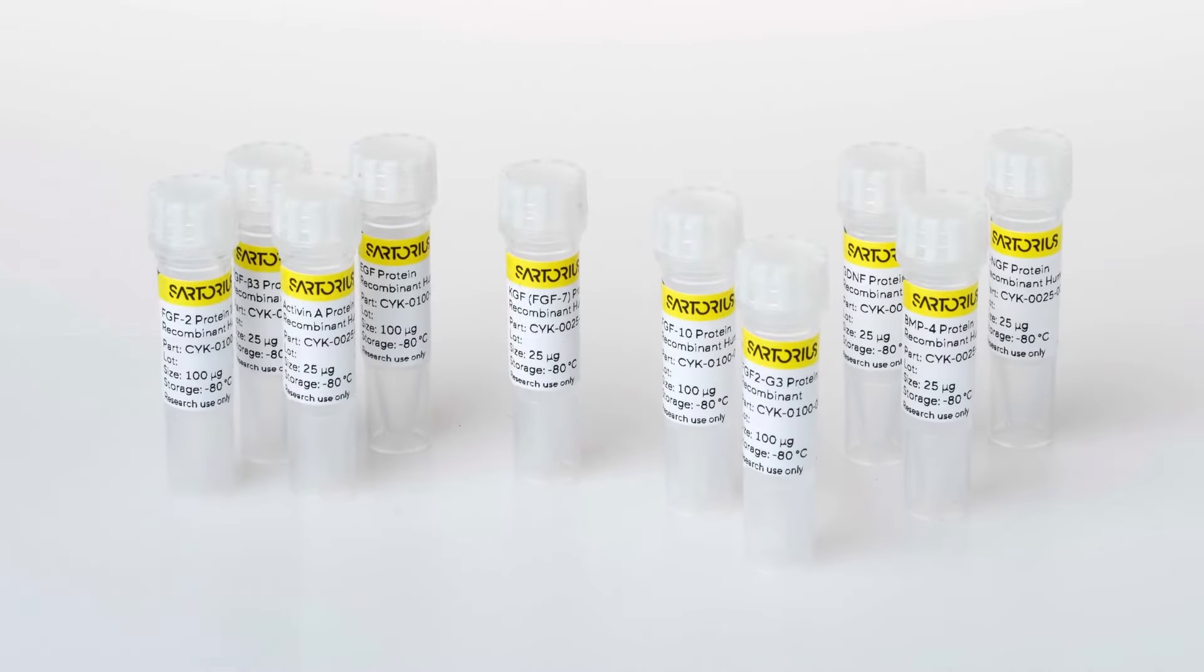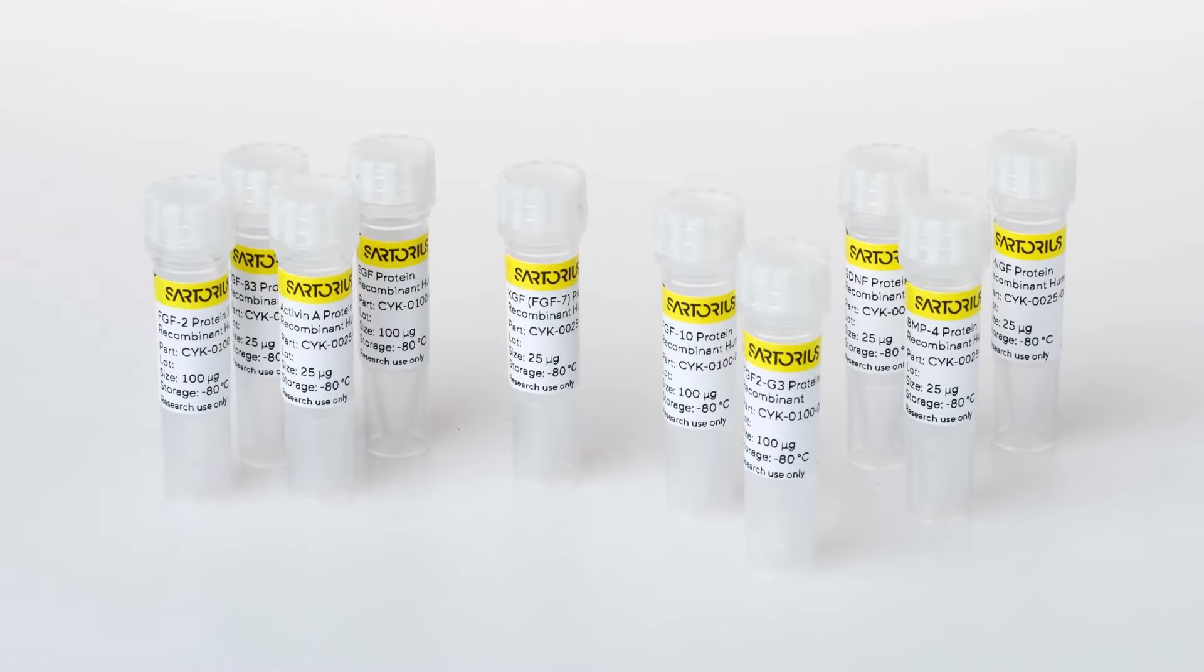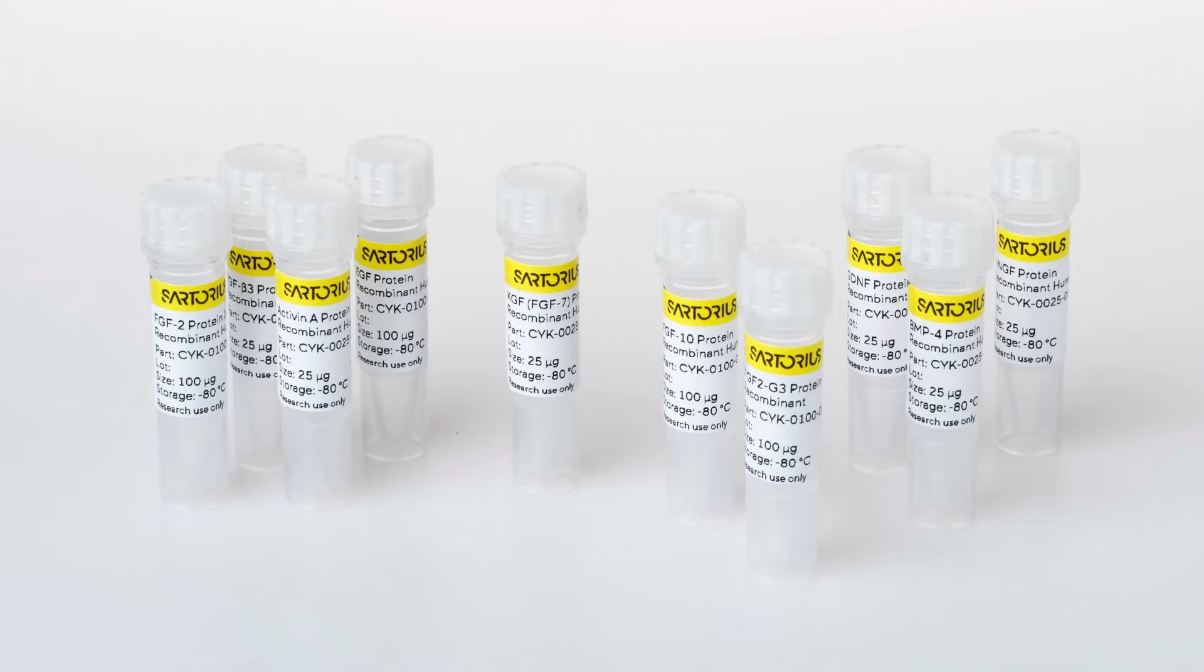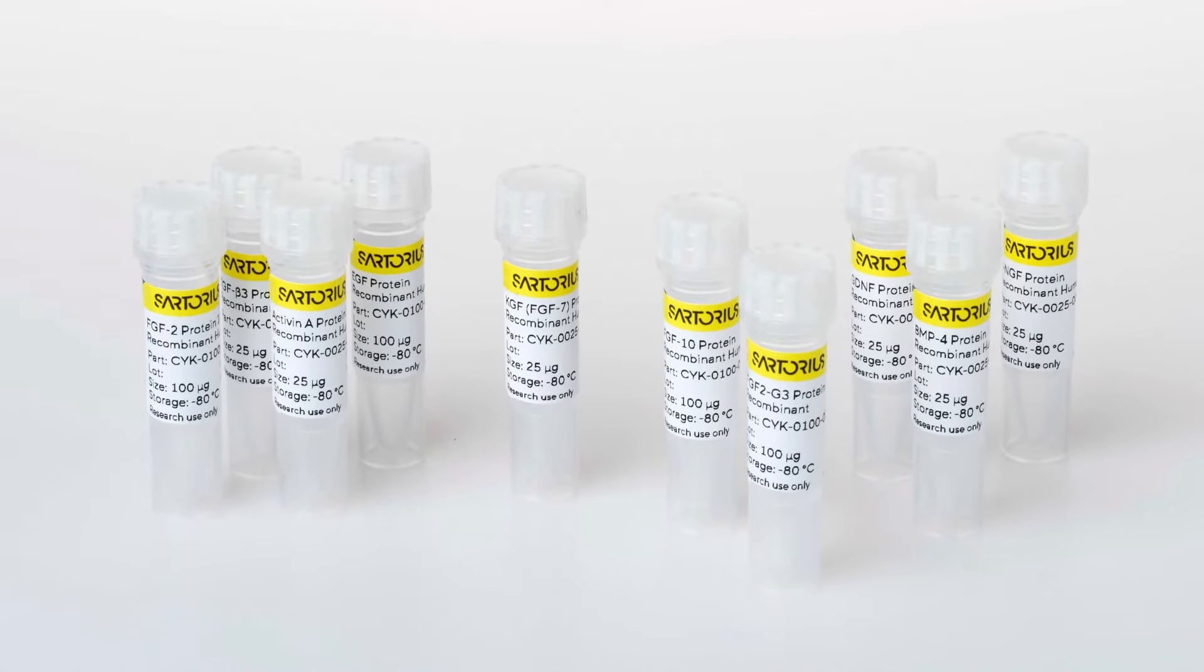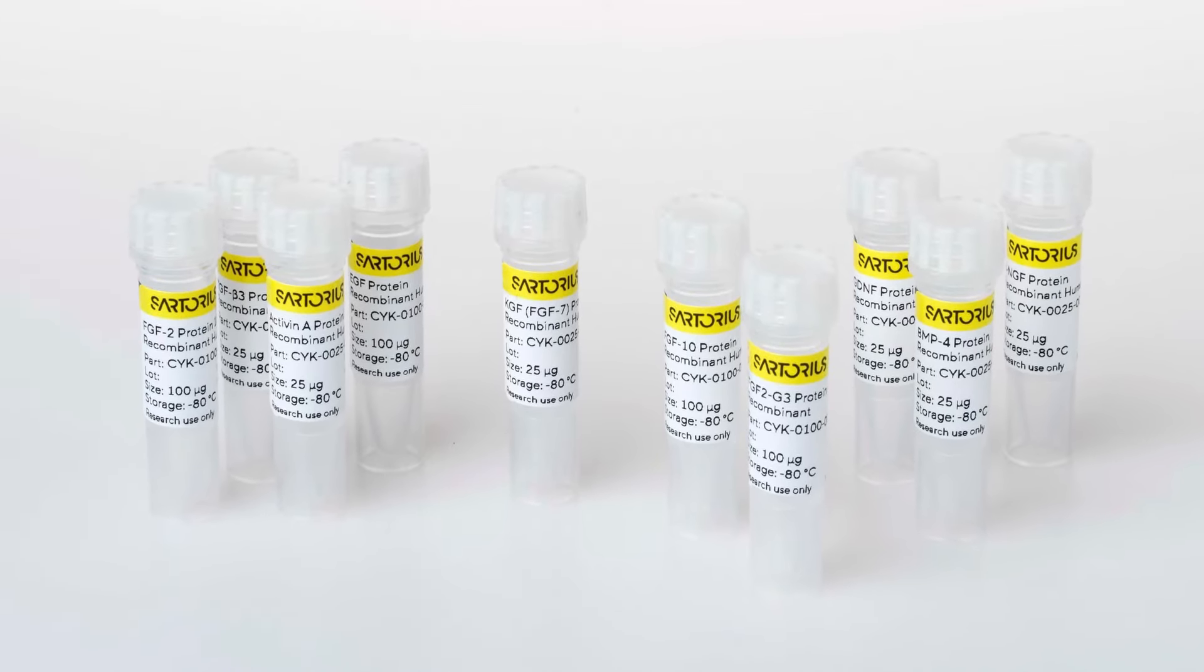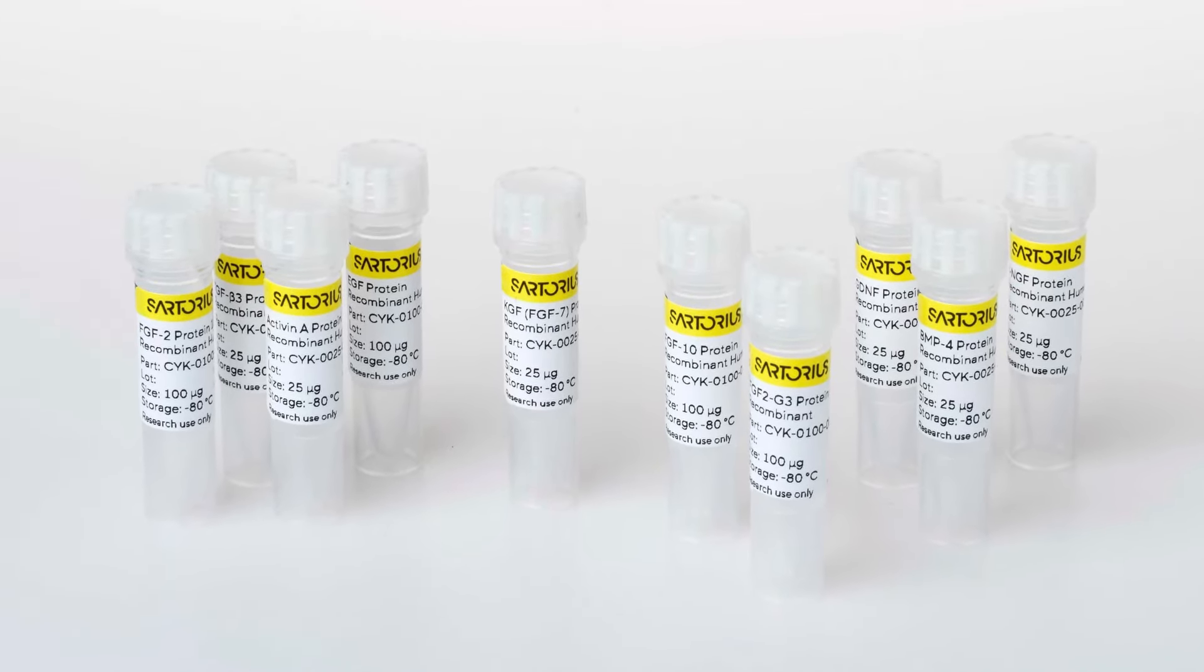Sartorius are introducing a new range of recombinant human research use only growth factors and cytokines to their portfolio for life science research.